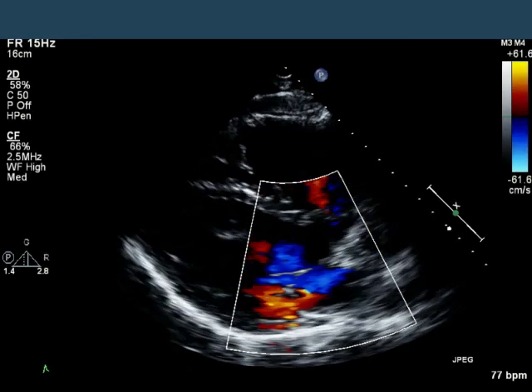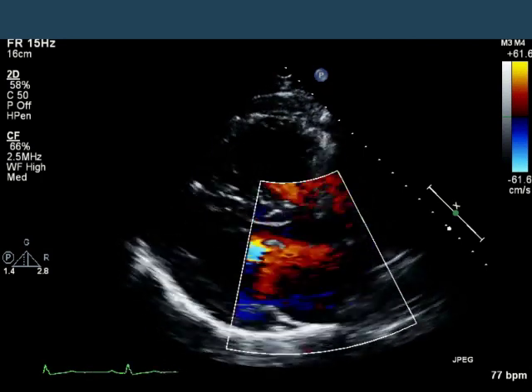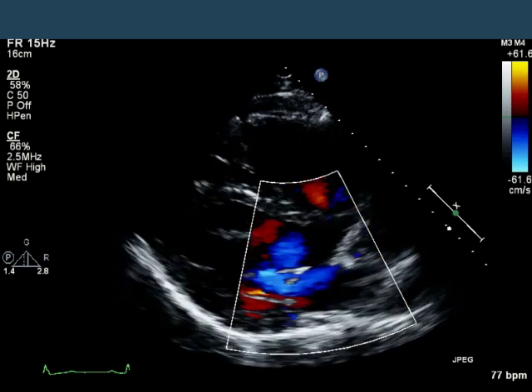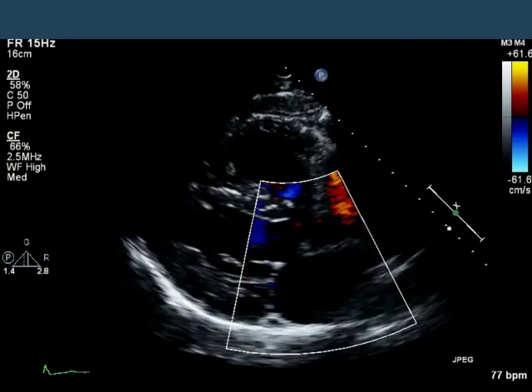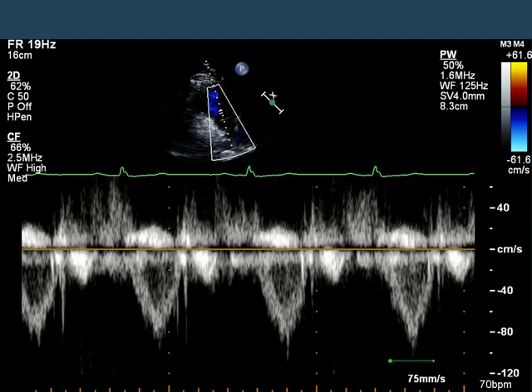Here we have a parasternal long axis with color, and you'll notice the color flow through the mitral and aortic valves is normal. Here we have a pulse wave Doppler through the right ventricular outflow tract. The right ventricular ejection period is 290 milliseconds, which is normal. The velocity through the RVOT is normal, so this doesn't look particularly unusual. The one parameter we don't know for sure is the diameter of the right ventricular outflow tract, so to calculate flow precisely we would need that parameter, and we don't.